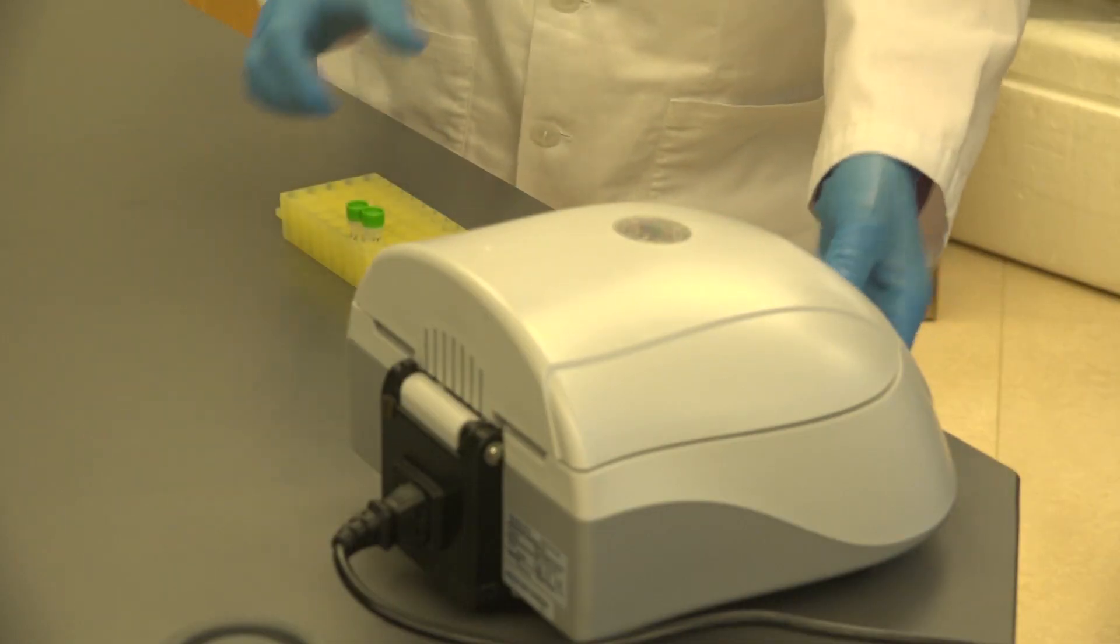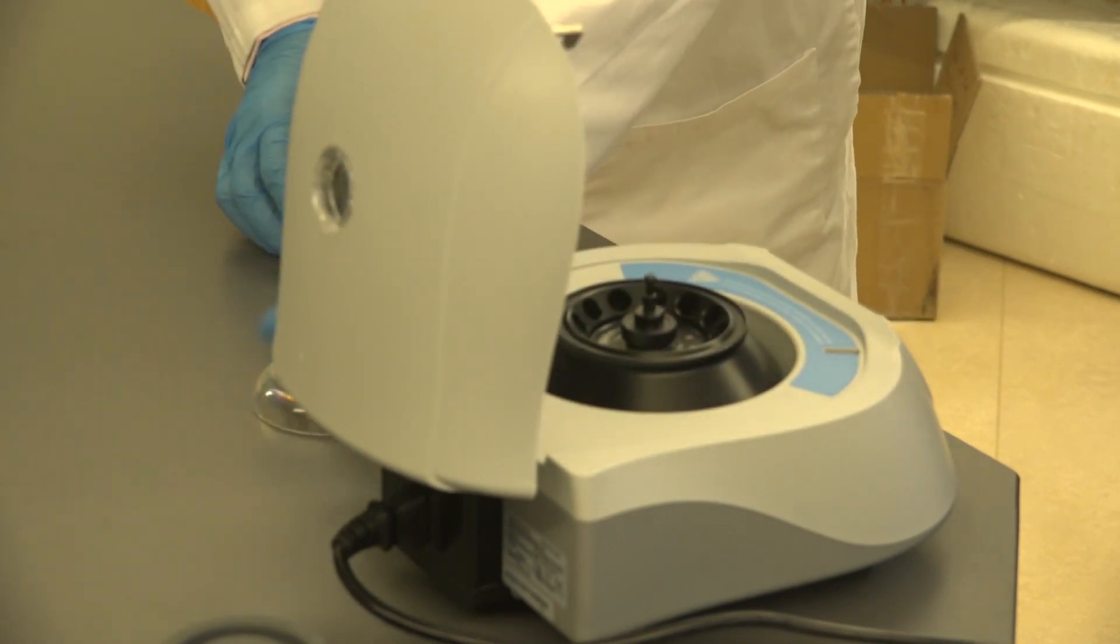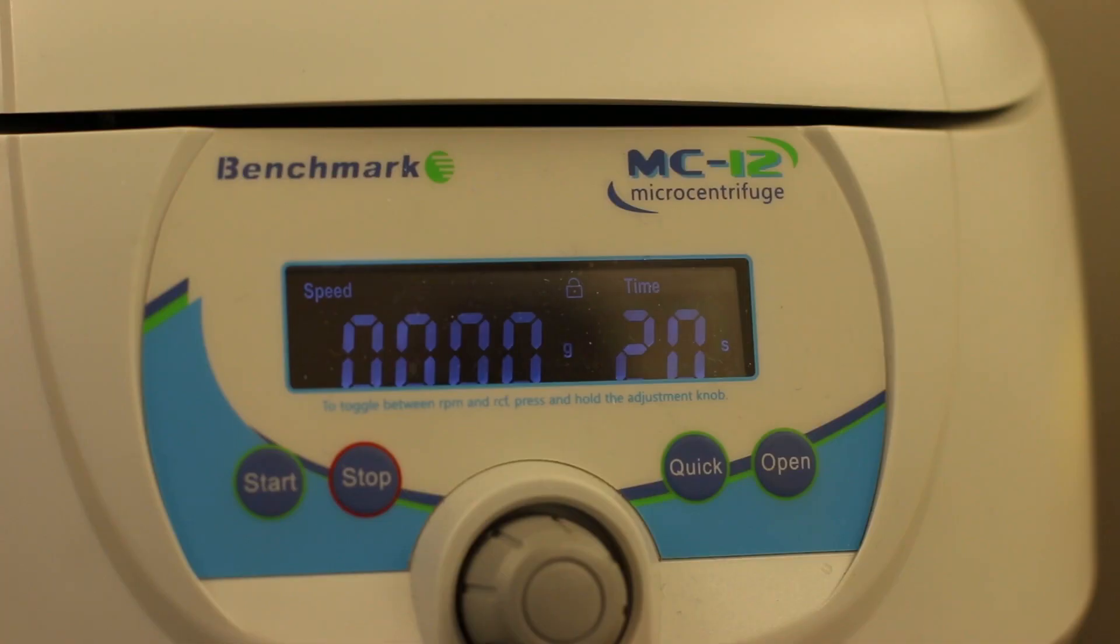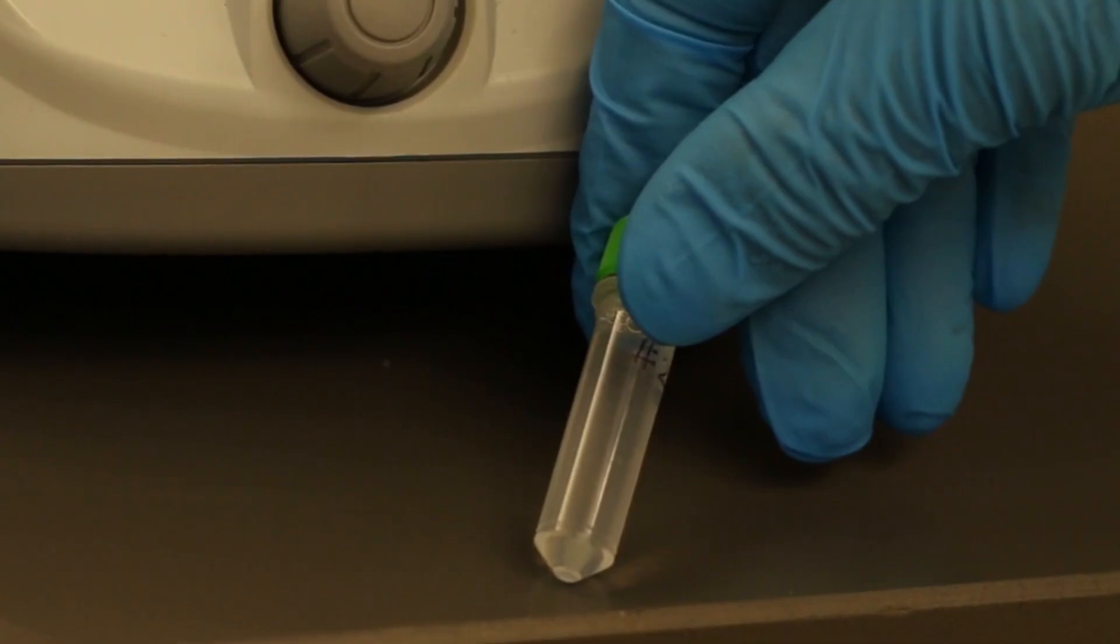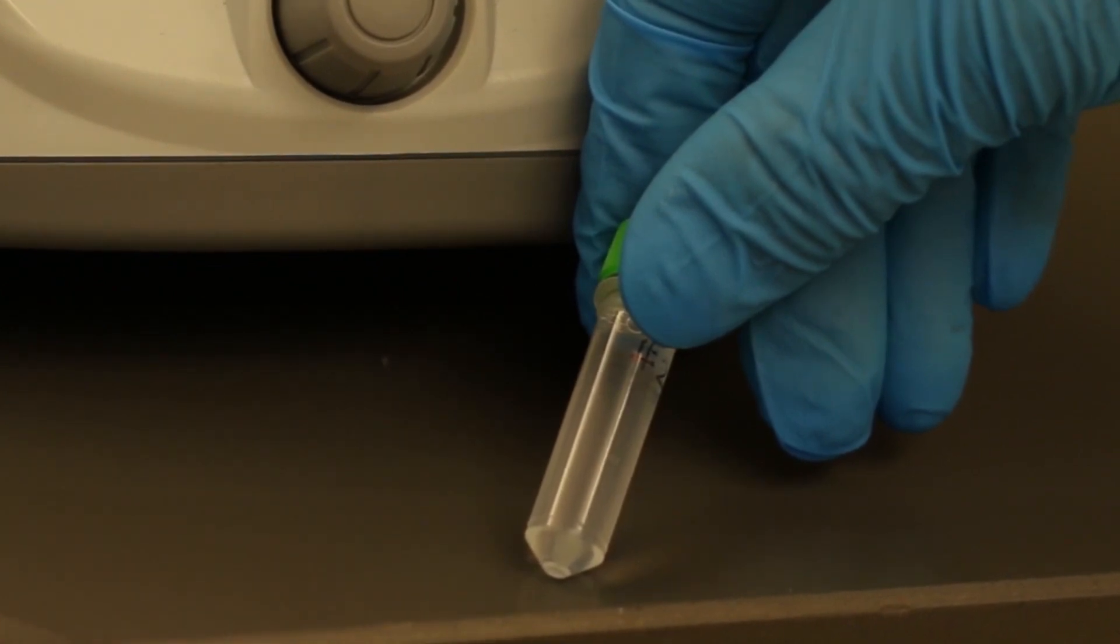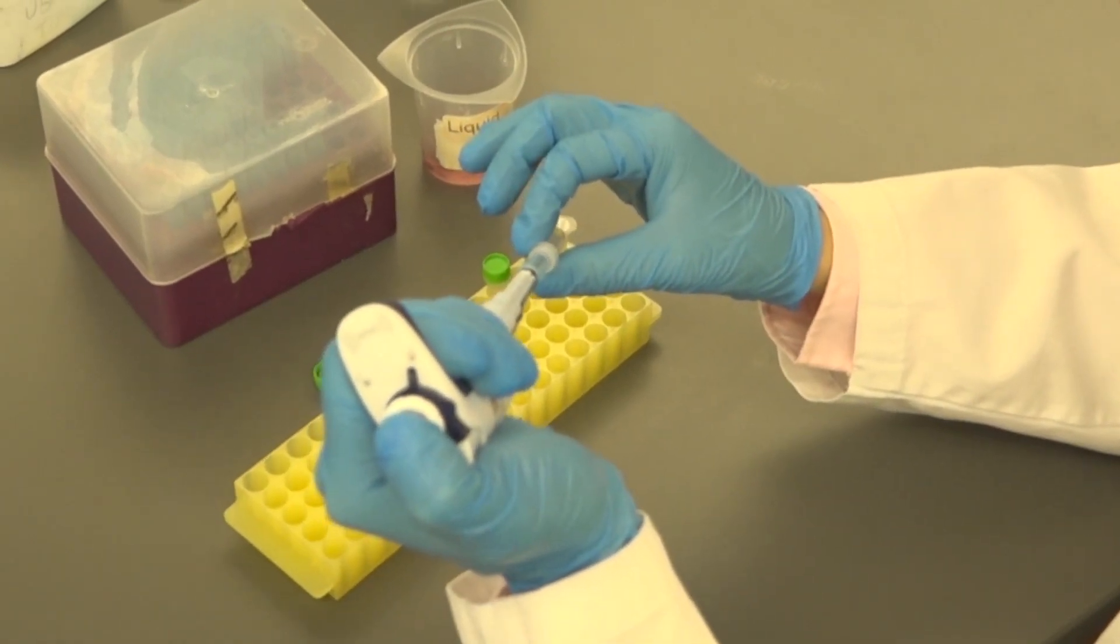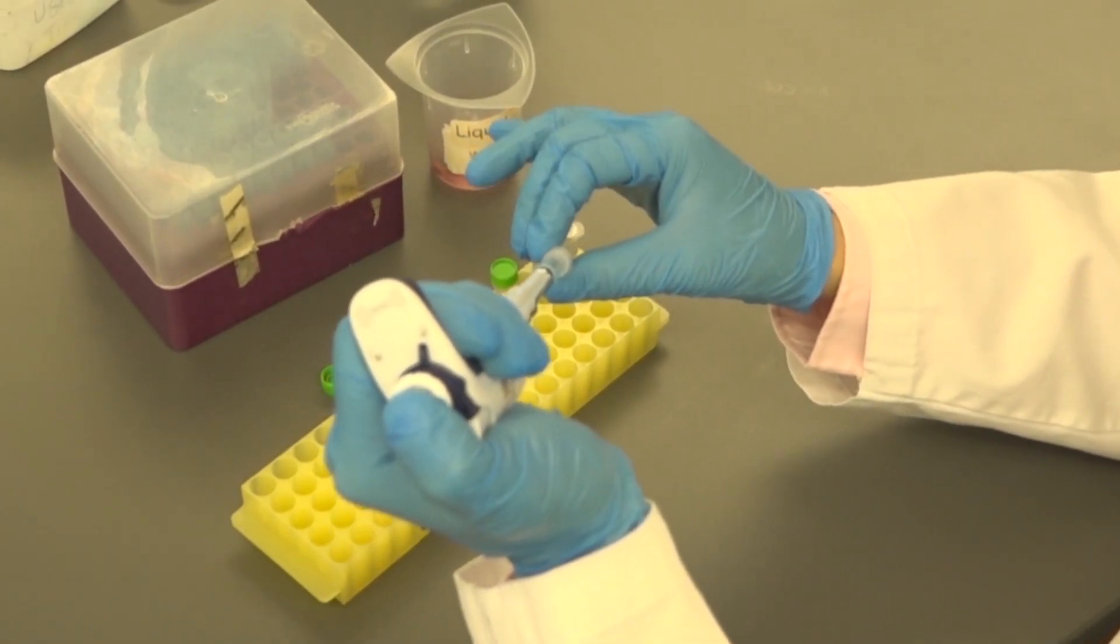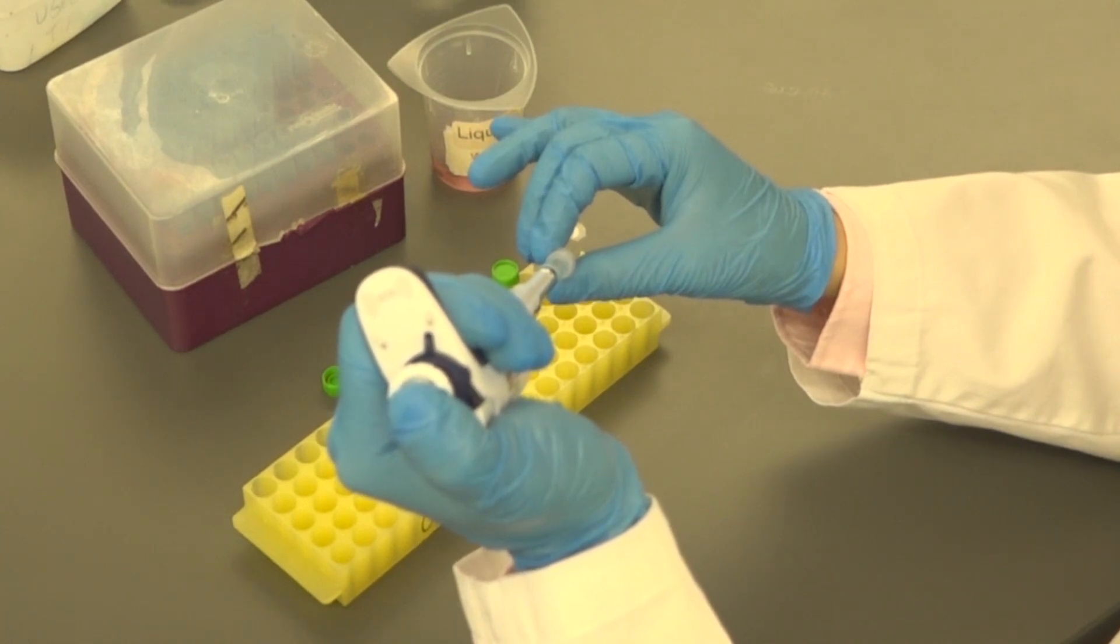After cells are collected from both dishes, centrifuge both tubes for 3 minutes to pellet down the cells. After the centrifugation is complete, check to make sure there's a white cell pellet at the bottom of the tube. Use a P1000 to remove as much supernatant as possible without disturbing the cell pellet.